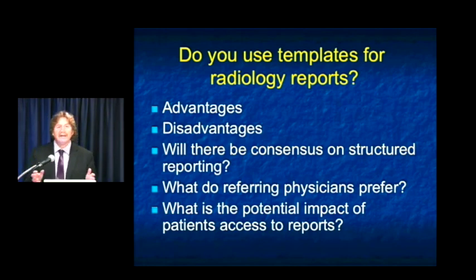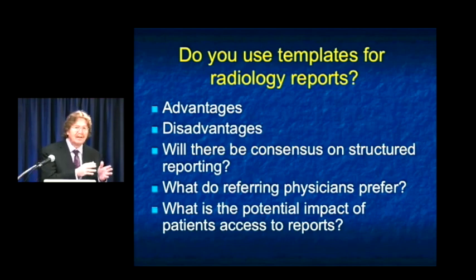So in many ways, one of the things that we like to look at in this series of talks is that radiology is not yesterday's radiology. Radiology is changing every day, and I think it's very important for all of us to really be on top of that change. We need to be leading the change, whether it's in how we look at the images or how we report the images or what we participate in.